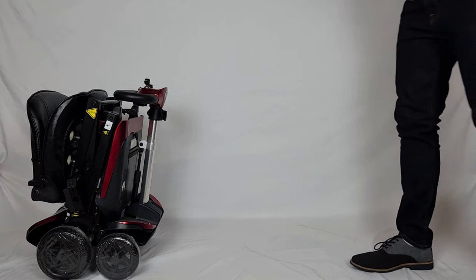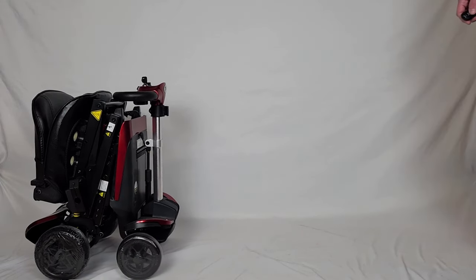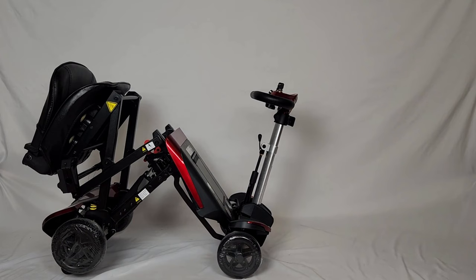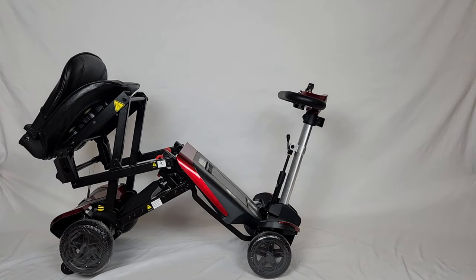To unfold your Transformer scooter you're just going to press the other button once, and then press it one more time once it stops.